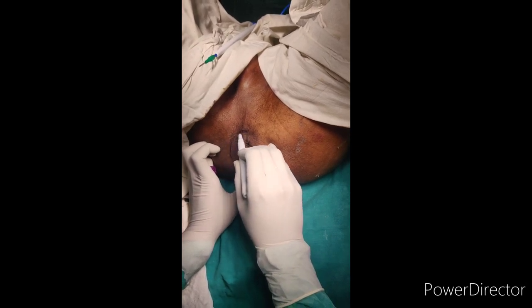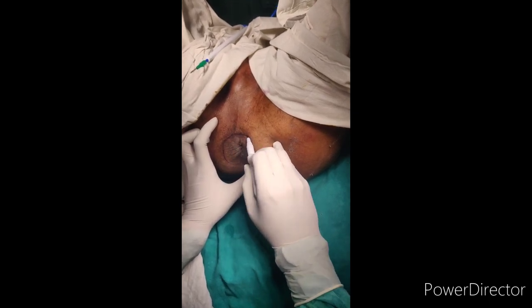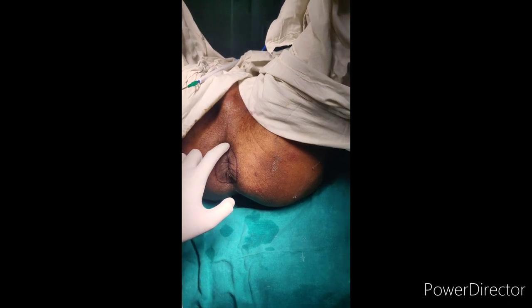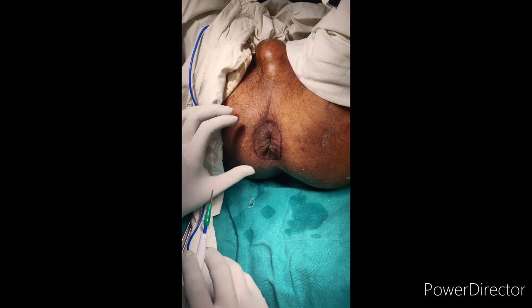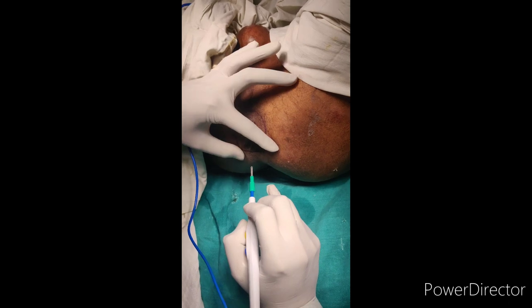We will be joining both markings so that we will be in that plane. The suture will be passed from the entry point downward side to the exit point upward, which was marked. I am palpating the deep sphincter muscle again. Now we will be entering into the sphincters, going below the superficial external sphincter. The entry point will be the lower one.